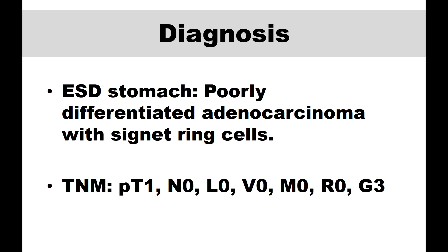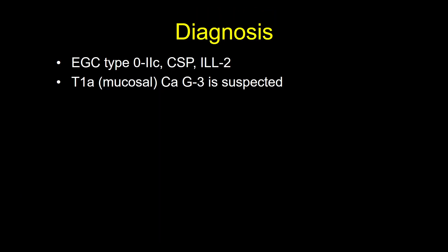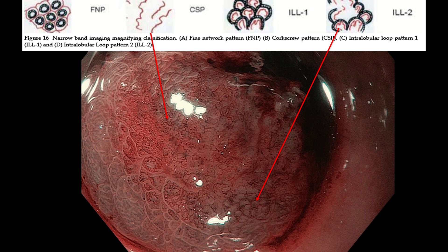This is a really nice case which nicely demonstrates a typical appearance of signet ring cell carcinoma. Usually a well-differentiated adenocarcinoma is divided into protruded type and depressed type, which has the same color as the background or is a little bit reddish. Unlike well-differentiated adenocarcinoma, poorly differentiated adenocarcinoma is usually very flat or depressed and looks whitish. So finding a white patch is a kind of sign of signet ring cell carcinoma.